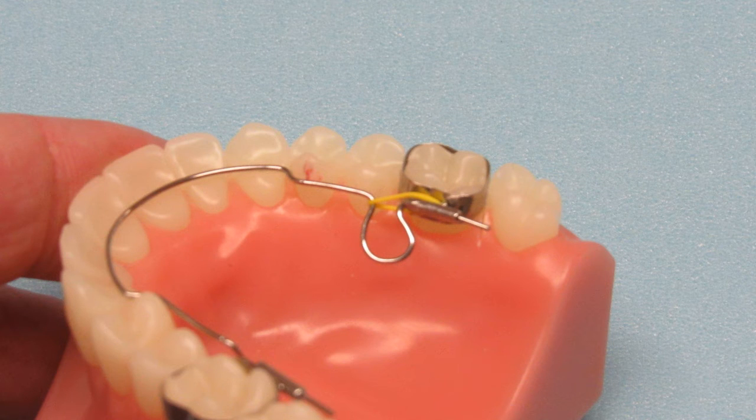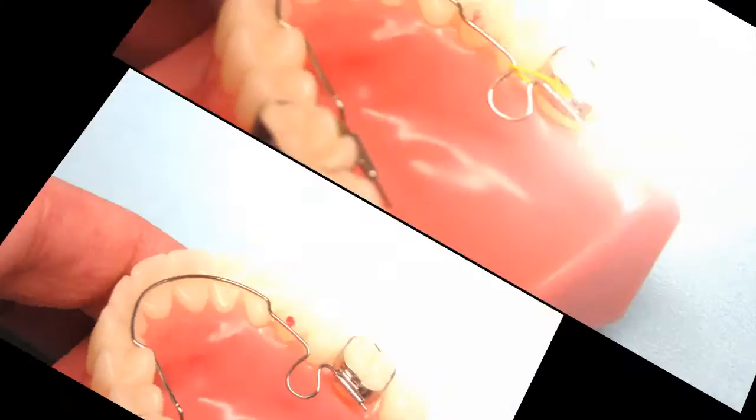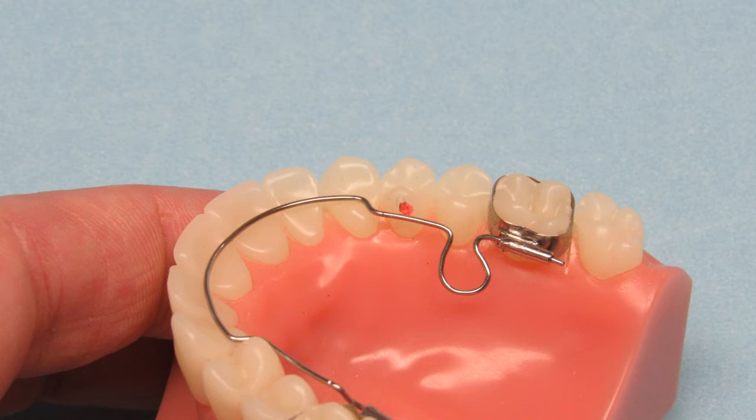After activating the appliance, tie it in place with a ligature wire or elastic tie. This will prevent the wire from sliding out as the patient wears it. You'll need to remove the elastic each time you take the appliance off to activate it. It will be very important to place a composite anchor on the lingual of the premolars on each side to hold the wire in place and prevent it from riding up the lingual of the teeth. The composite anchor will direct the force and provide optimal movement.